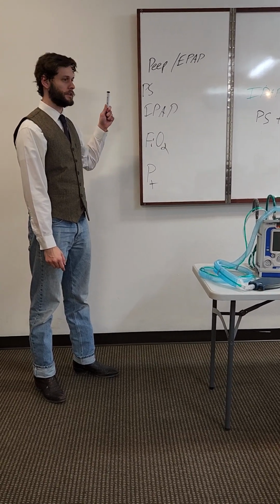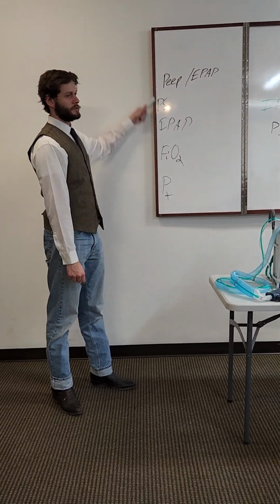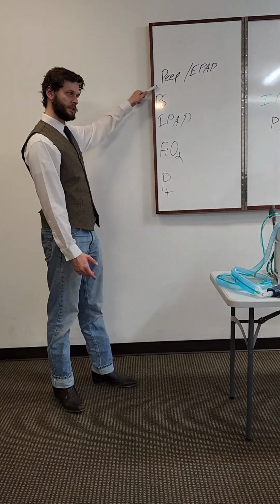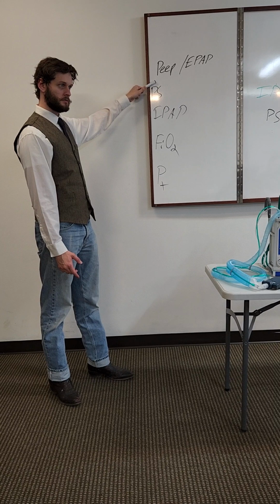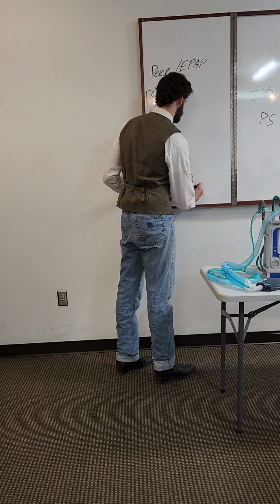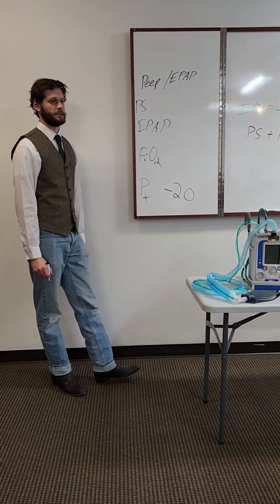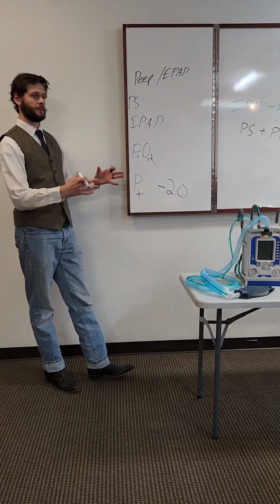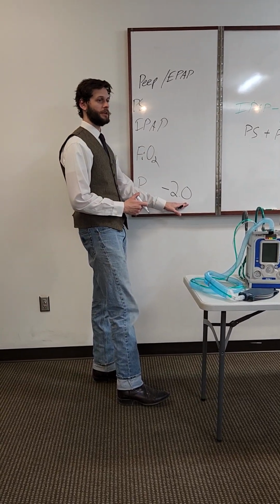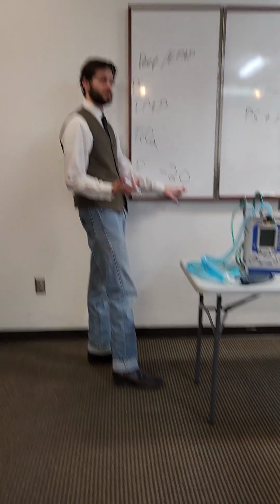Since this mode is completely regulated by the patient, them being able to initiate this is arguably probably the most important part of it. If the patient cannot initiate this breath, it is worthless. The biggest problem with this vent is that it's going to start out your pressure trigger always at -2. This is the pressure, a negative pressure of 2, that the ventilator measures to initiate that breath. This may be too much for a lot of the patients that we're going to be taking in BiPAP or CPAP from the ER to the ICU, because they're not able to draw that breath.